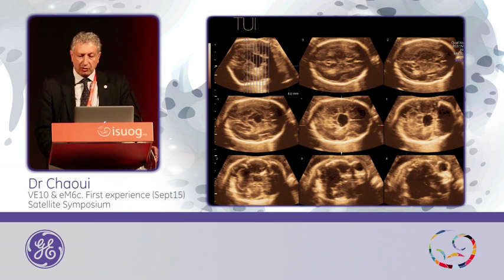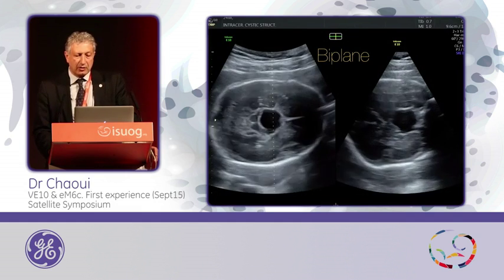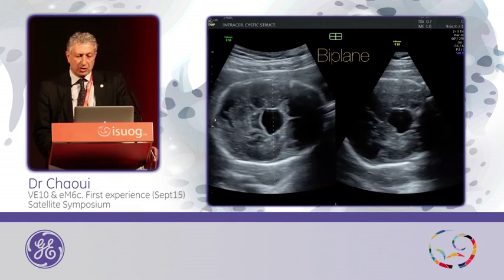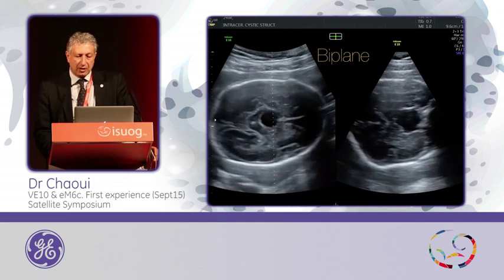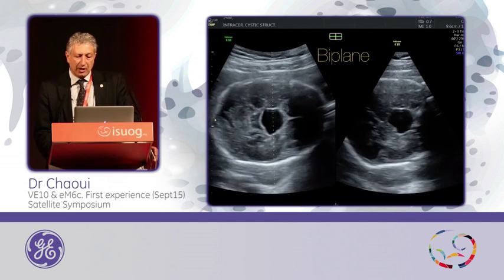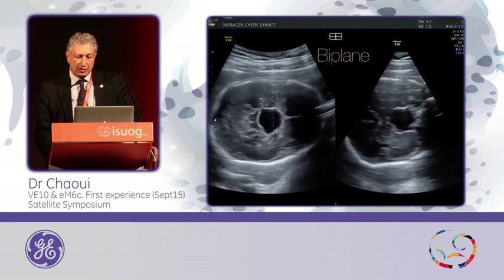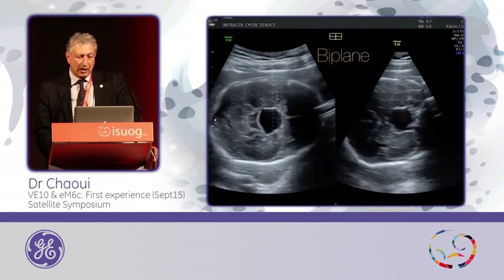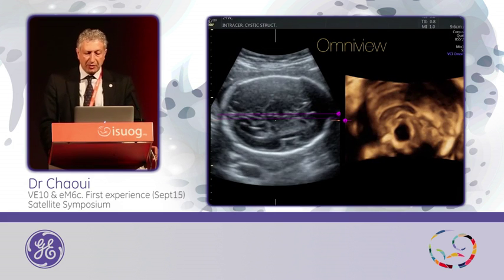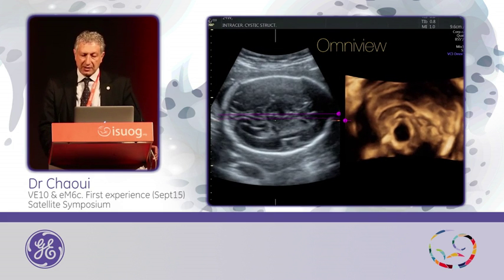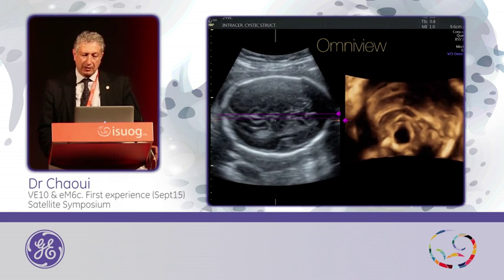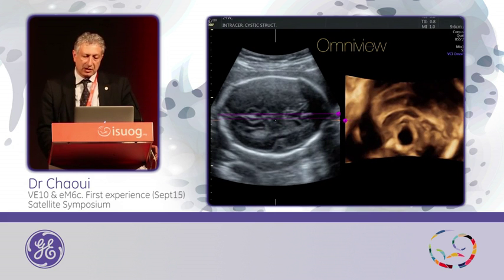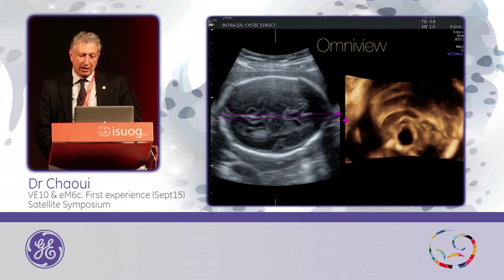And then you can use the biplane to see the surrounding structure, and you see the shape is cystic or circular in all directions, and you see here the cortex appears well. Then you can use OmniView to see the relationship of this cyst in comparison to the corpus callosum — meaning it is just under the corpus callosum, where our vein of Galen would be present in the posterior part.